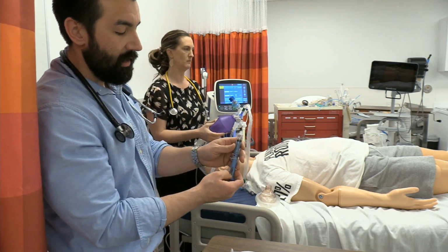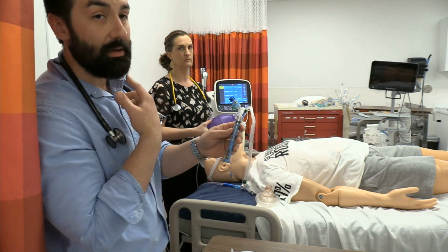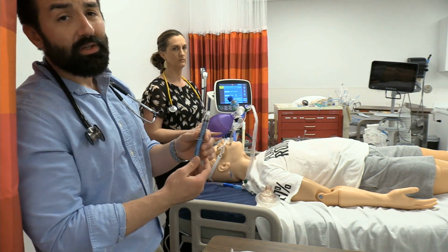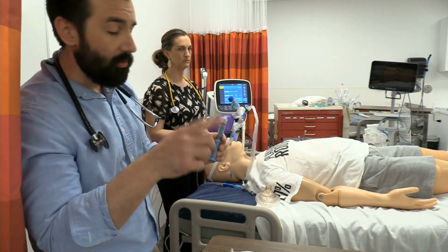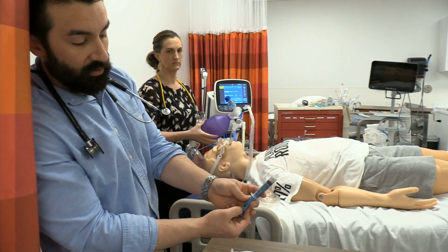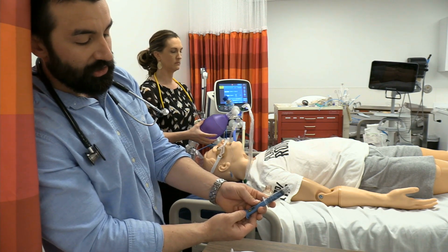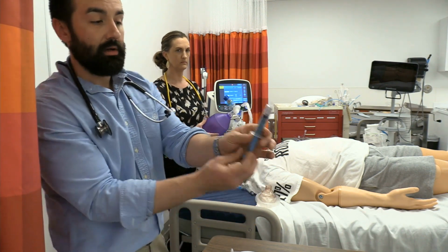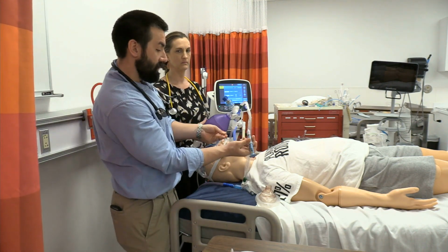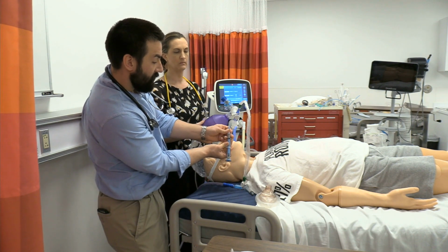So we'd like to see that cuff pressure no greater than 30 centimeters of water because we can get tissue ischemia and run into some problems after extubation. Below 20 centimeters, though, even though we might be thinking we're sealing the airway, we could get microaspiration and stuff dripping down leading to VAP. So this little throwaway cuff manometer is good for single patient use. You hit the button to turn it on, get a little volume of air, usually pull back 2 or 3 mils here in case I need to add anything. Usually it's overinflated. I'm going to swiftly and deliberately attach that.